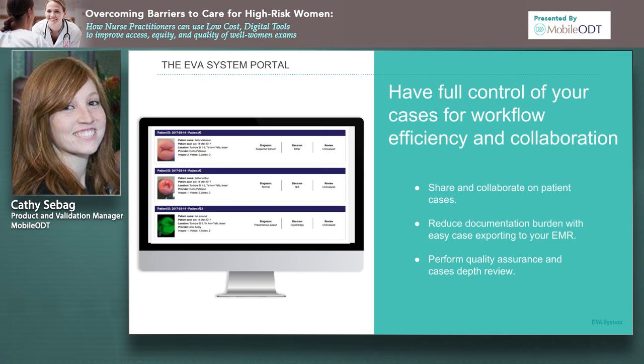So if you have trainees in your clinic who are working underneath you and you want to assess their diagnostic accuracy over time, you can open this special QA portal and say you agree with their decision or you disagree. And you can put in the type of treatment or diagnosis you would have made based on the colposcopy and the information inputted. And it will automatically calculate all of your trainees' rates of overdiagnosis or underdiagnosis, as well as general agreements. So you can make sure that they're getting the right supportive supervision on the challenges that they face most.